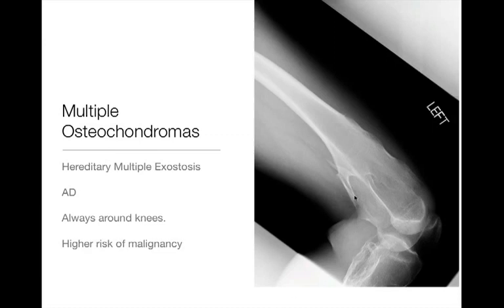In this patient about the knee there are multiple osteochondromas — a sessile one and maybe a pedunculated one off the distal femur, and one in the more proximal fibula. They share all the characteristics of a normal osteochondroma, being in continuity with the cortex and underlying marrow. An interesting point about multiple hereditary exostosis: if you want to confirm the syndrome, a good bet is to image the knee — they tend to occur about the knee, so if you find them there, it's a slam dunk.